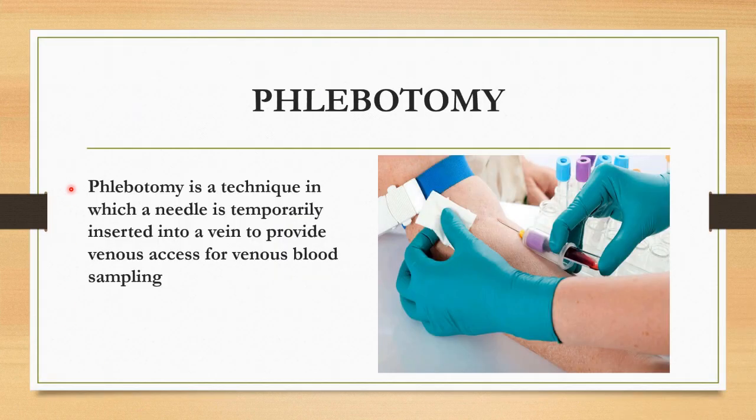Phlebotomy. Phlebotomy or venipuncture is a technique in which a needle is temporarily inserted into a vein to provide venous access for venous blood sampling.